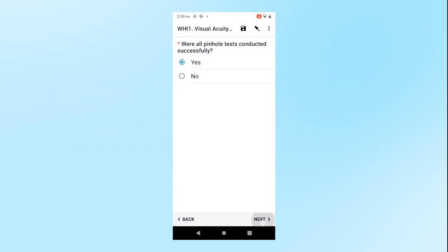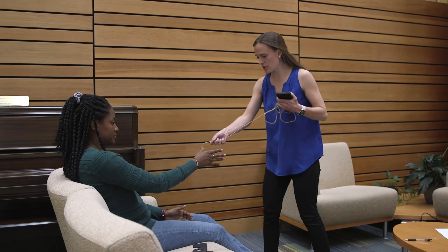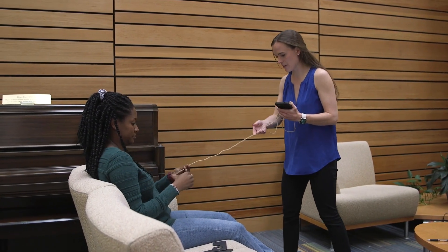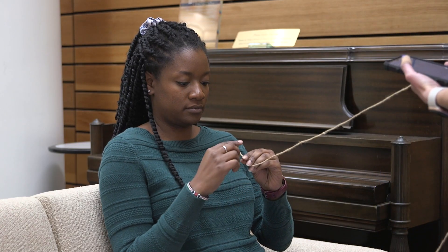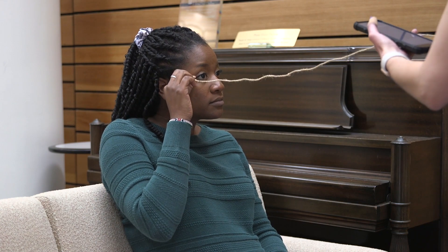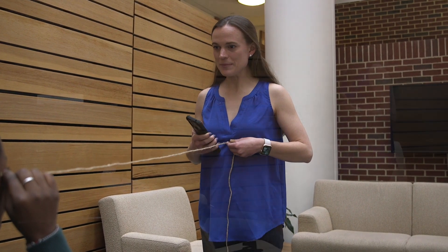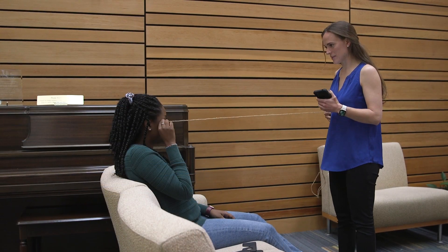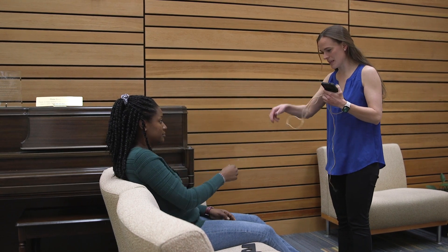When you complete the Visual Acuity Screening, you will reach the page that says Contrast Sensitivity Screening. You will need to stand one meter from the participant during the Contrast Sensitivity Screening. Have the participant pick up the end of the study string and hold the end of the string near their eyes. Take the other end of the string and walk until you are at the knot in the middle of the string. When the string is fully stretched out and at eye level with the participant, you will be one meter apart.